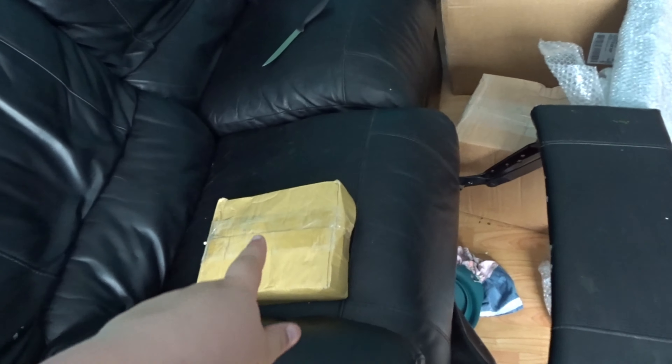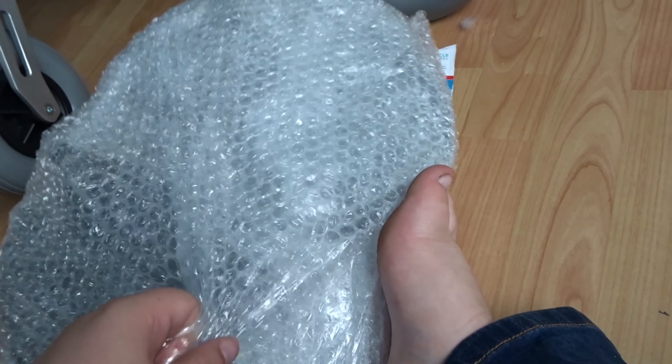Okay, so we have that box, that box, stuffing bubble wrap. We've got those as well. So let's open the stuffing bubble wrap and see what they are.